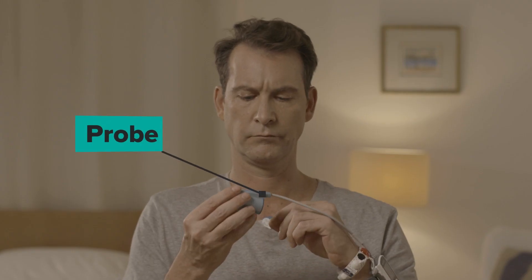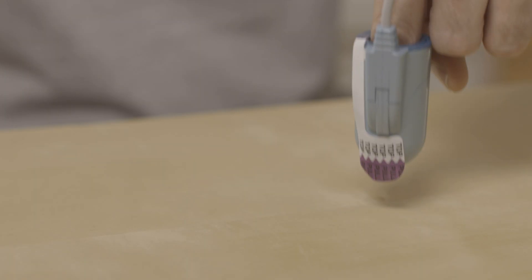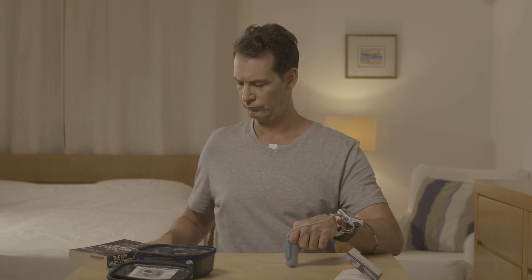Place the probe on the finger that you have been told to use, preferably the index or ring finger. It is normal to feel a little bit of pressure. Insert your finger all the way into the probe. The tab labeled 'Top' should be situated on the top side of your finger. While pushing your finger against a surface, like a table or your leg, gently and firmly remove the tab. Be careful not to twist the probe.